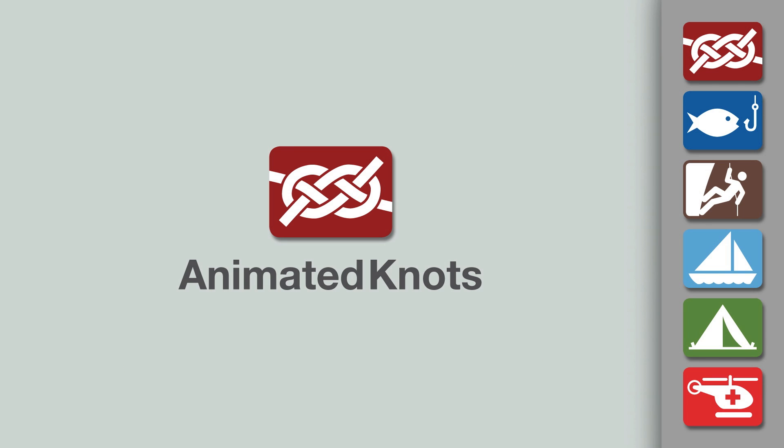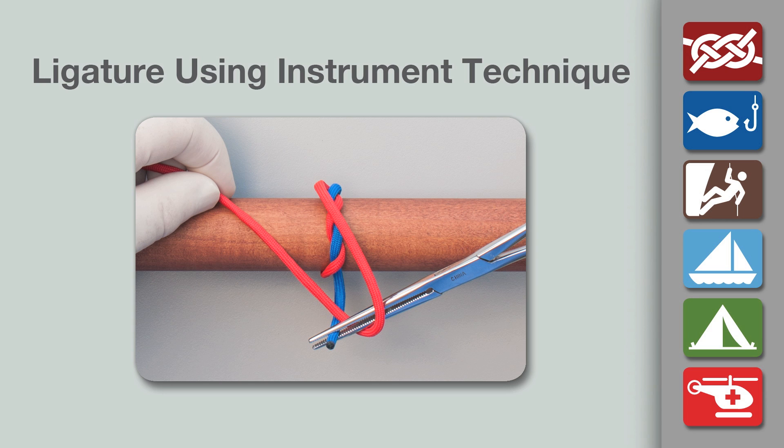Welcome to another knot-tying demonstration from AnimatedKnots.com. This video teaches you how to tie a surgical ligature using an instrument technique.